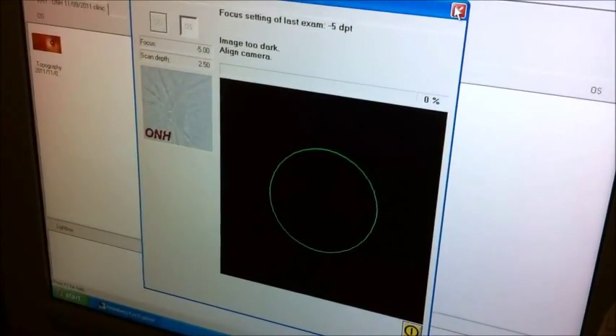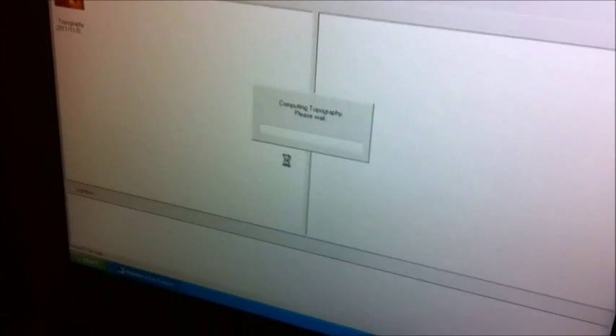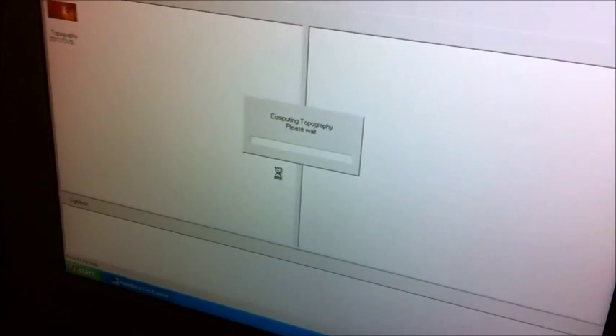So when we hit the X up here, it's going to ask us if we want to calculate the topography. We're going to say yes. It usually takes a moment or two.